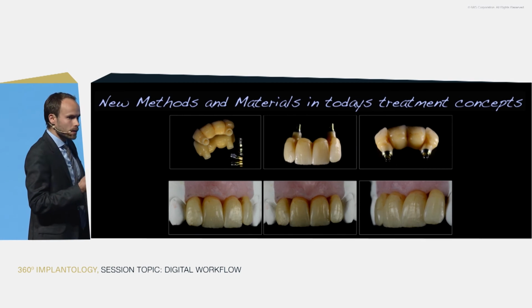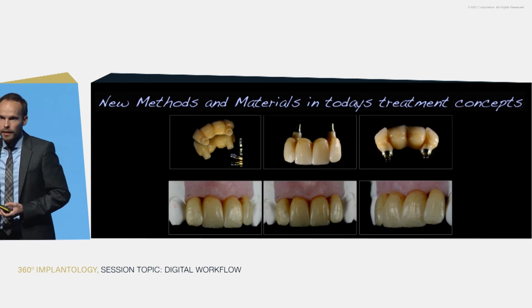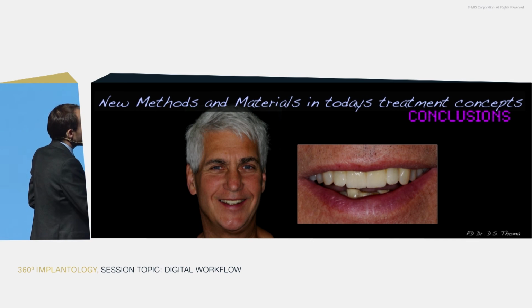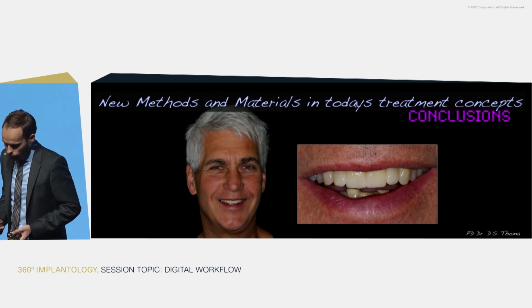But keep in mind that this ceramic that we apply manually just doesn't reflect the strength that our monolithic reconstructions deliver for us. So here's the final patient with this, I would say, minimal invasive layering just in the anterior zone.